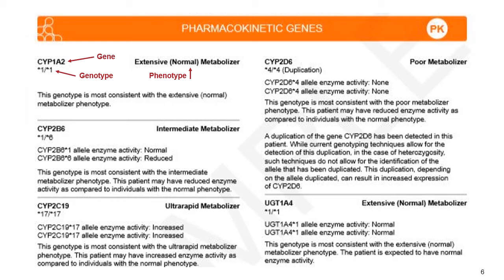And then the other one I want you to pay close attention to is the CYP2D6. So this is a poor metabolizer phenotype. And so this is the opposite of what I had said before. And in this case, a prodrug that is metabolized by CYP2D6 would not be as effective, and an active drug is more likely to cause more significant toxicity or adverse effects in this patient when used at typical doses.